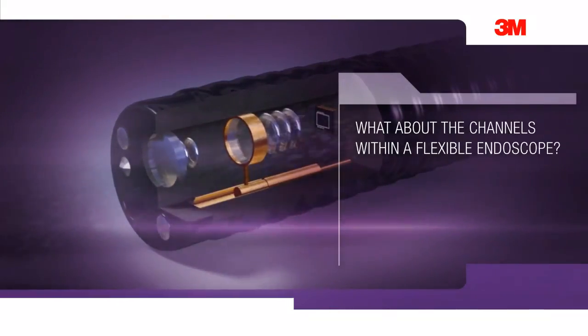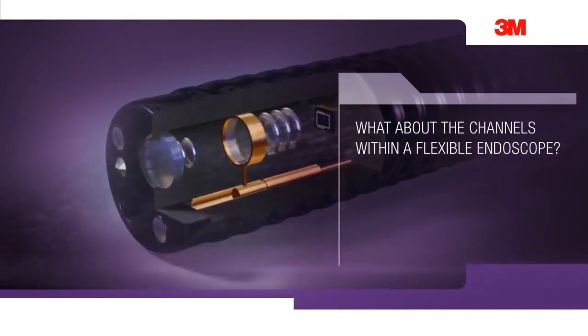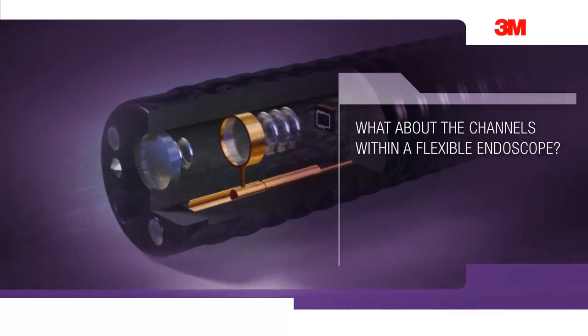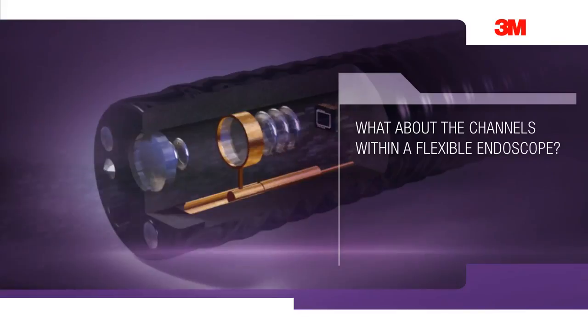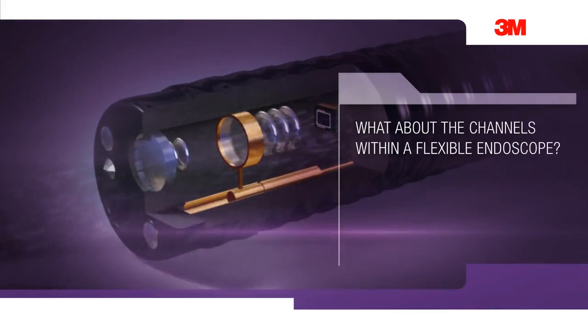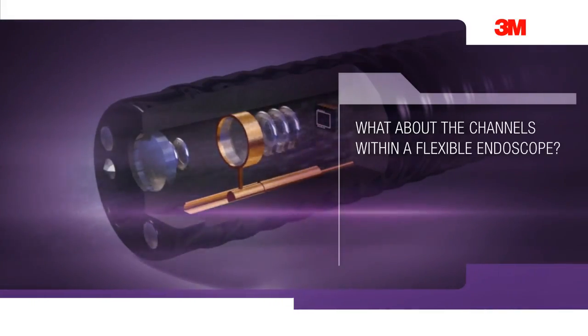But what about the channels within a flexible endoscope? The complex and narrow lumens simply cannot be directly inspected to determine cleanliness. Given how difficult they are to clean, it is highly likely they have unacceptable levels of contamination.